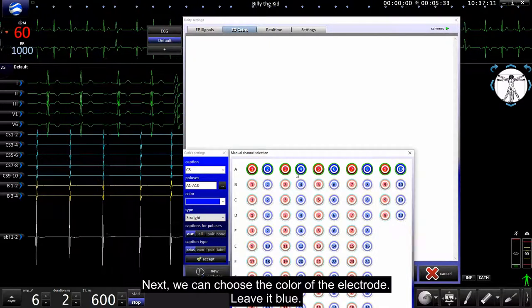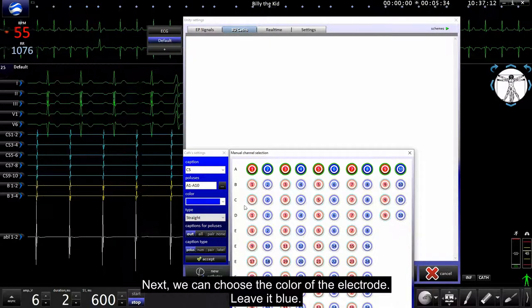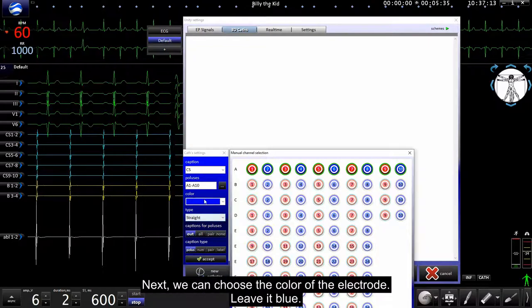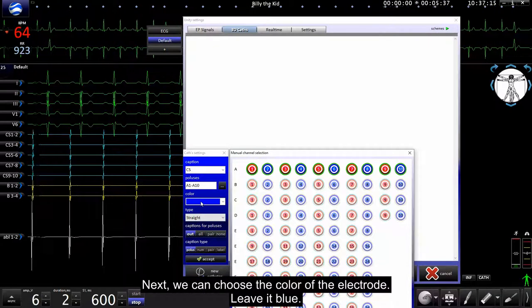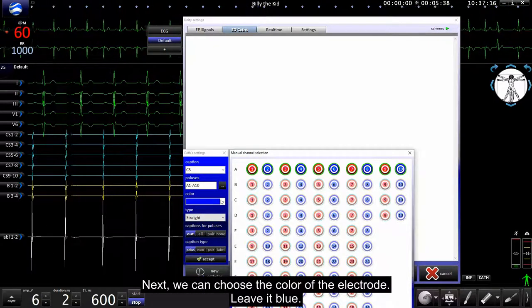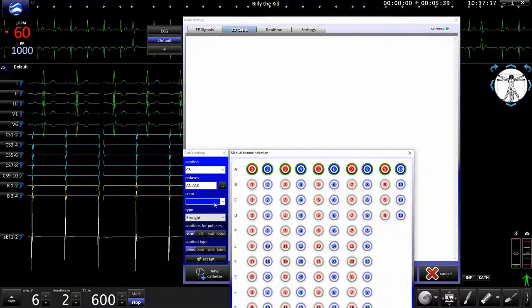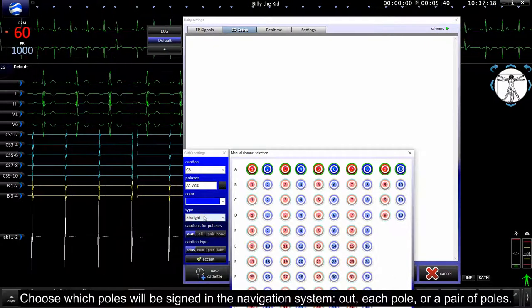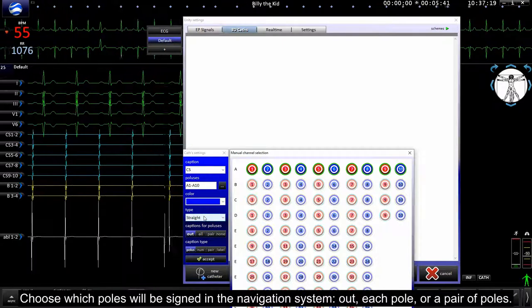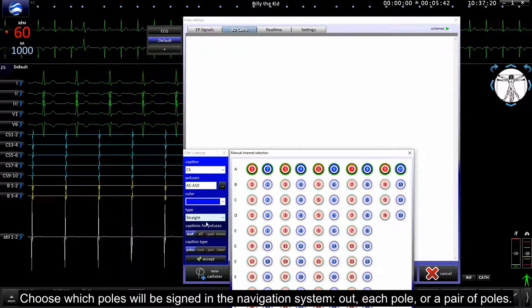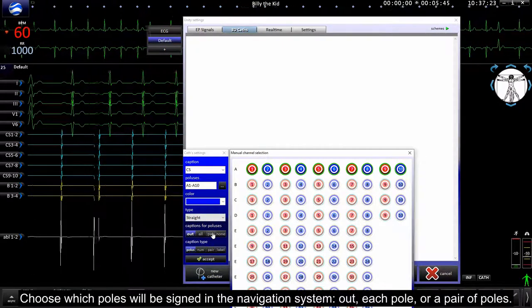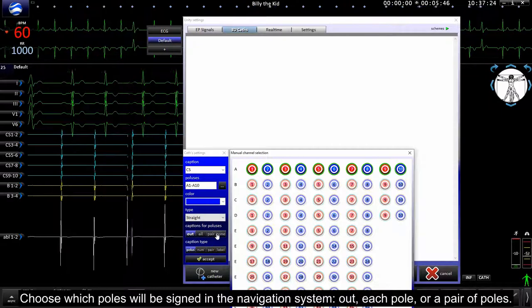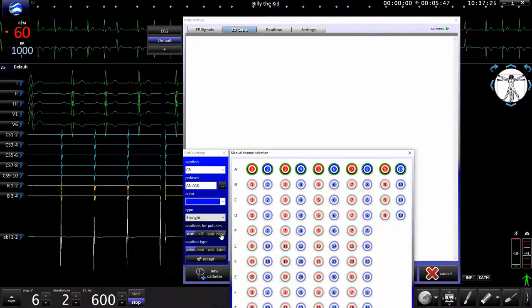Next we can choose type of electrode, color of electrode, left with blue. Choose which pole will be displayed in the navigation system: each pole, pair of poles, or none.